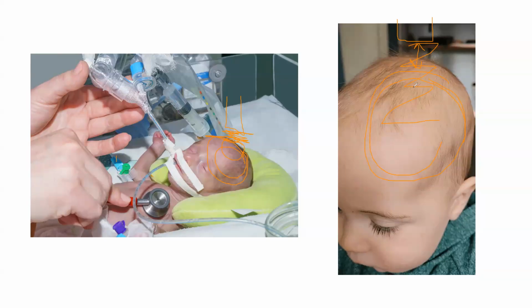Eventually, we come to a compromise between the frequency and the probe used. And again, when I talk about the protocol, I'll be able to explain it better to you when we talk about concepts of resolution, why that is the case. But that is the rough gist of frequency and wavelength. We tend to use higher frequencies for more preterm babies. We tend to use lower frequencies for term and near term babies. And really, at the end of the day, we then want to concentrate sound waves and we use the focus to try and optimize our image depending on the depth. Does that make sense? Yes, thank you.